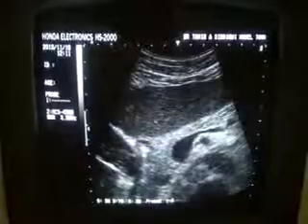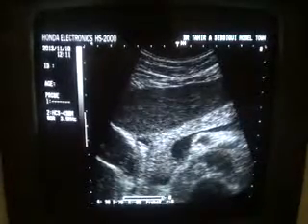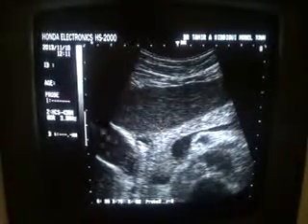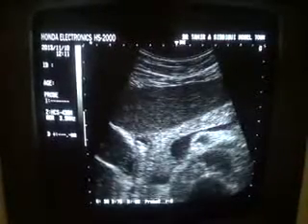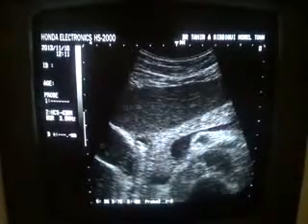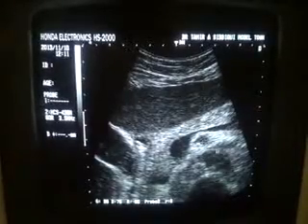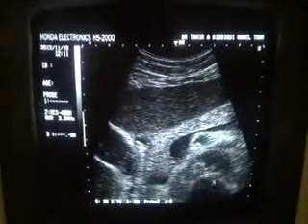Here I am getting the gallbladder along with the pancreas. This is the gallbladder and this is the pancreas. This is the splenic vein, portosplenic confluence, superior mesenteric artery in transverse section, the aorta, and the spine.